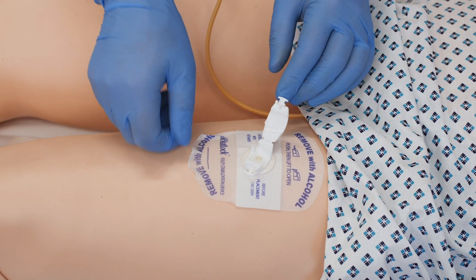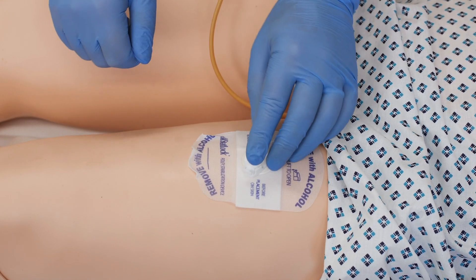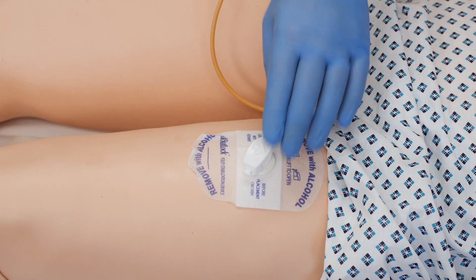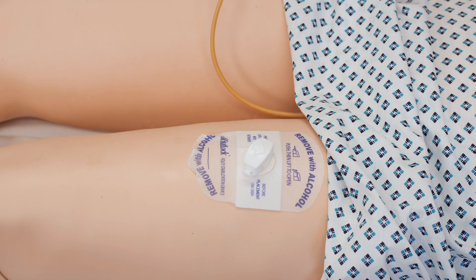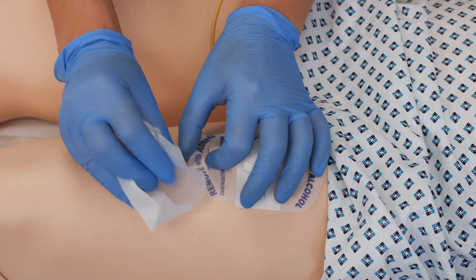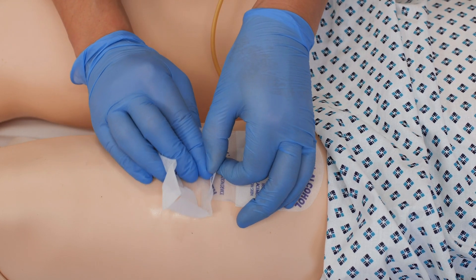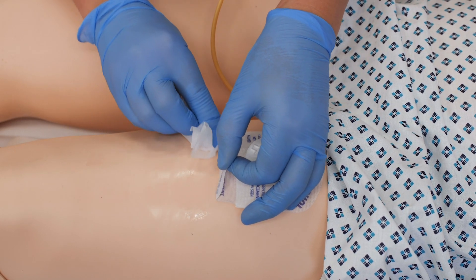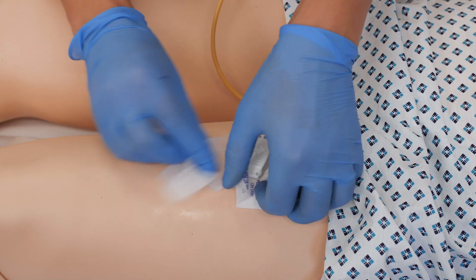That's to stop any trauma when pulling at the device as you remove it from the patient. It's recommended you use five to six alcohol wipes to remove it - the sticker does say 'remove with alcohol' - but it is patient dependent how many you use. The aim is to not cause any trauma or discomfort to the patient.